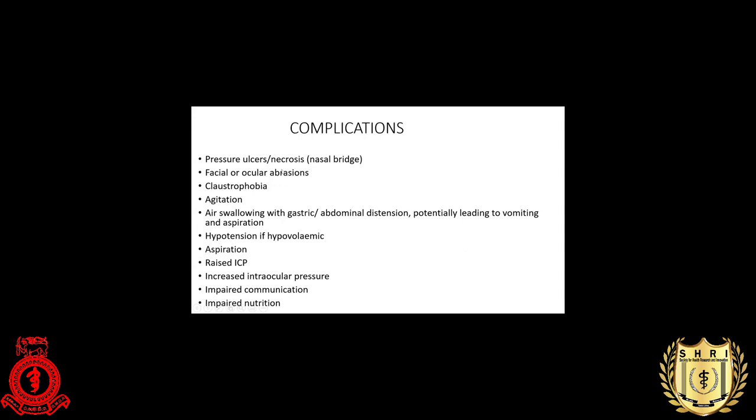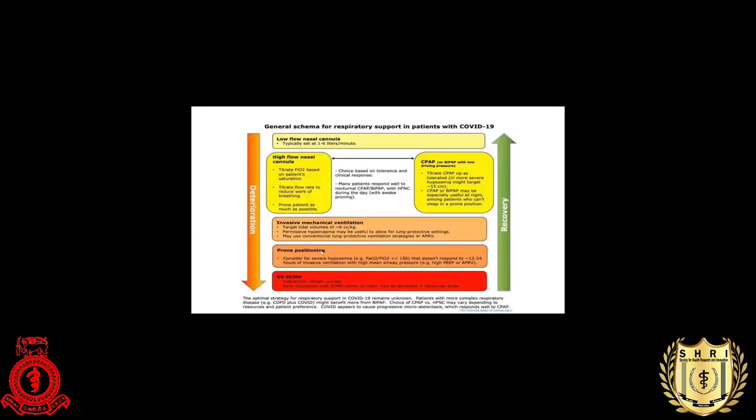It causes claustrophobia and agitation, and can cause hypotension in a patient who is already hypovolemic. There's increased risk of aspiration, and increased risk of raised intracranial pressure and intraocular pressure. And if you put the patient on a mask, it's difficult to give food to this patient.